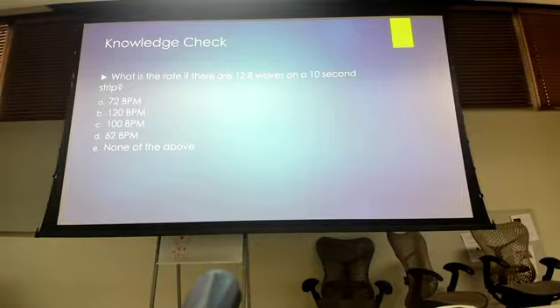Okay, what if you have 12 R waves on a 10-second strip? Torres, Stephanie Torres. Time to math, yes. 12 times 6 is 72. All right, ready? Oh! Great. Y'all are really going to have to work on your catching game. Come on. All right. Yes, 12 times 6 is 72.